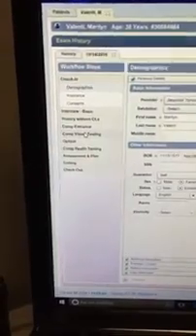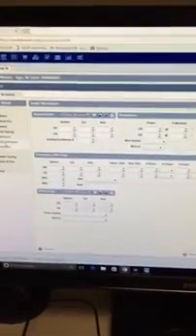Okay, so I created an encounter for Revolution, and I just wanted to show you what you guys want to do. For the purpose of this example, I'm going to go down to comprehensive visual testing, which is right here. That's where the refractive data is entered. Here's the first screen. It says initial refraction, autorefraction, keratometry, lensometry, retinoscopy. The autorefraction, keratometry, and lensometry will be populated when we transfer that information from the Topcon autophoropter.